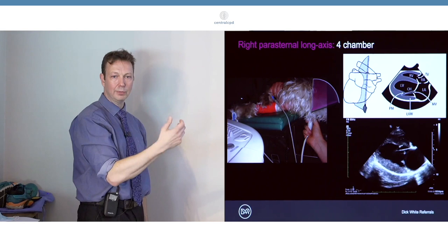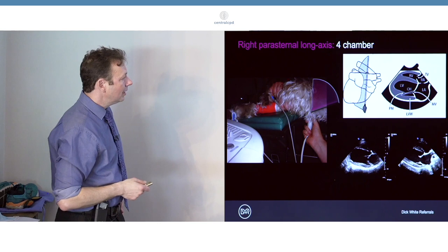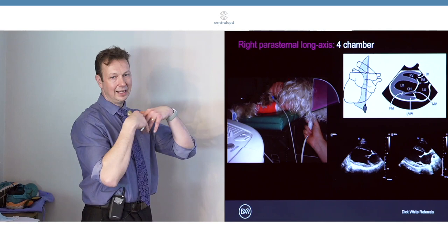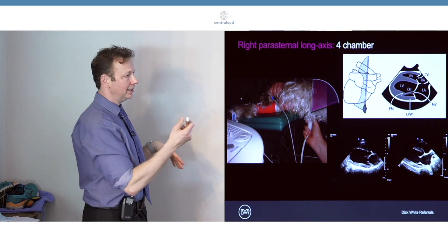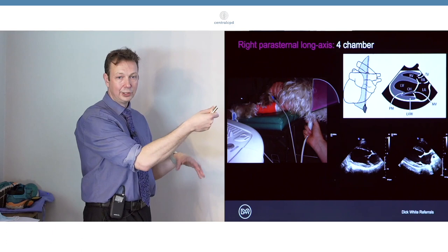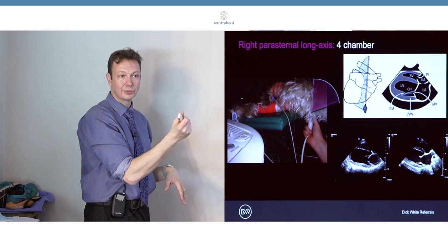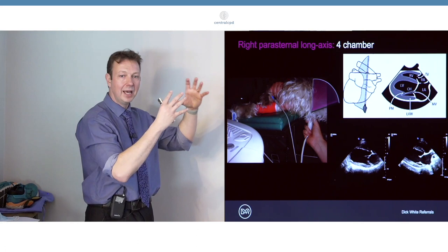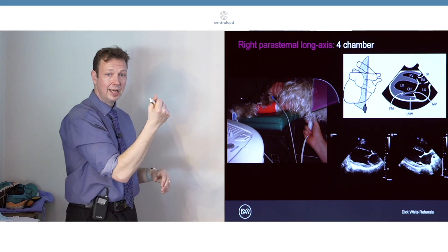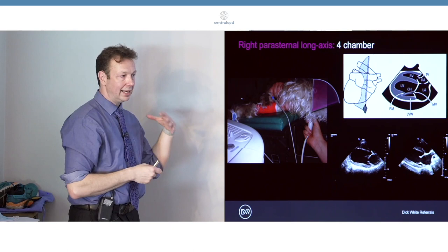You may find particularly with bigger dogs that in order to see the atria and the ventricles you can't do it all on one sector. What you might need to do is to angle upwards or dorsally a little bit to bring in the atria to optimize the image for the atria, and then conversely bring it back down again to optimize the ventricles. That's very common - you're not doing anything wrong if there's a big heart. It may be beyond the space of your sector and you might need to concentrate on the atria.